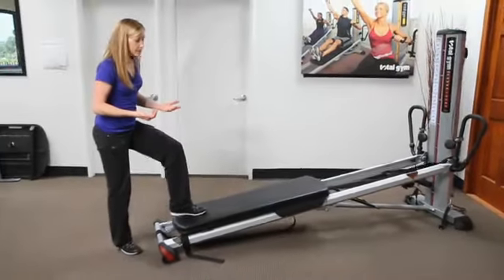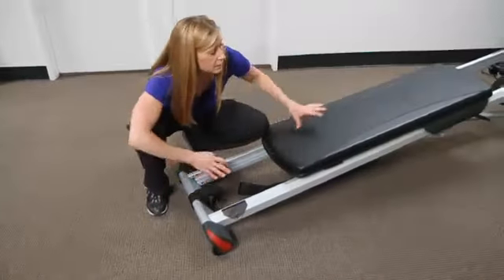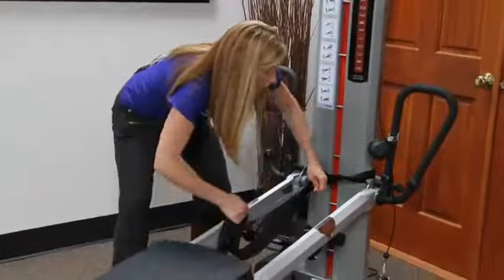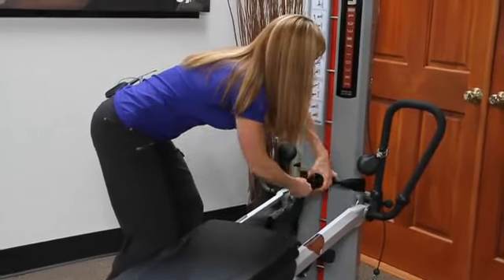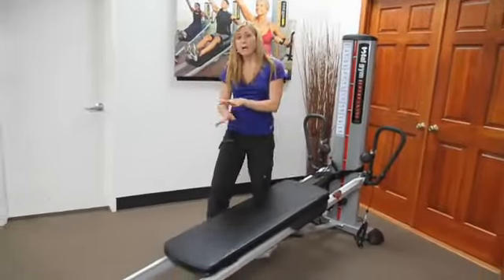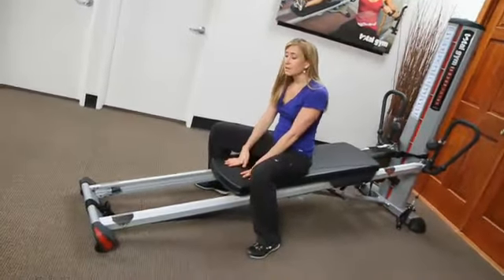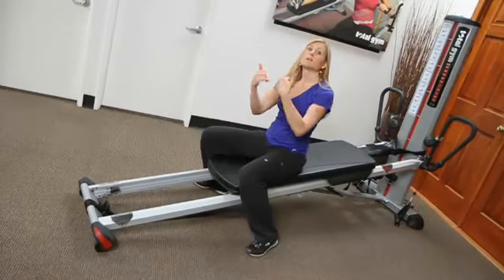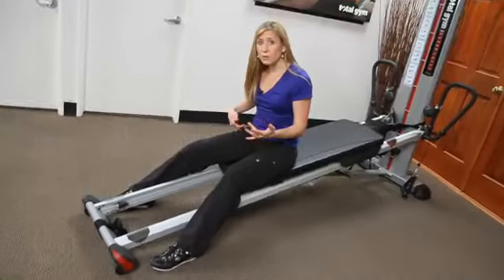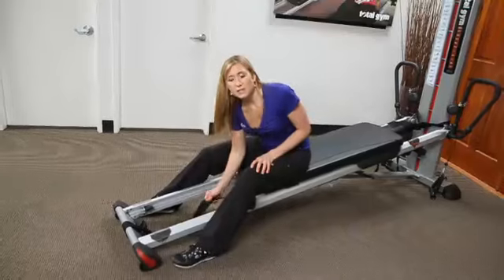What's also really nice is I can loosen up the strap and bring the board up like so. I use this all the time at the clinic with patients who are having a tough time just trying to mount and dismount the glide board — they can just straddle it and the board is steady. Whether I have the squat stand on and they're rolling back to do squats, or I want them to sit and work on pelvic stability with a little more assistance, you can use a slide distance regulator.